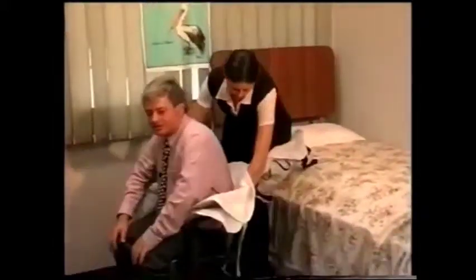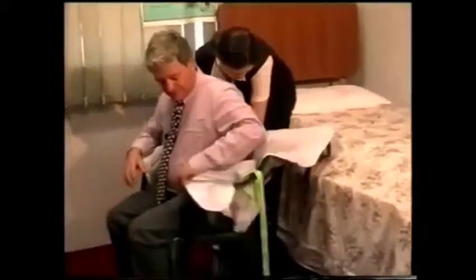So we start off, ask the patient to lean forward, or help them to lean forward, and just tuck it down at the back, around by the coccyx area. Move the hoist out of your way, and then one little tip I like to do is lift the patient's leg up. Can you show that, James?